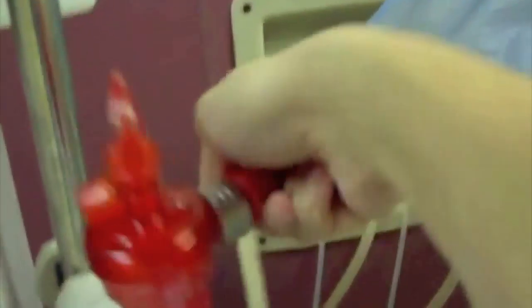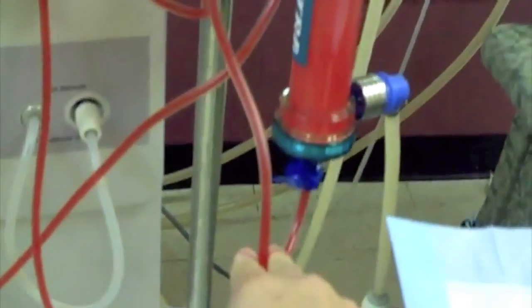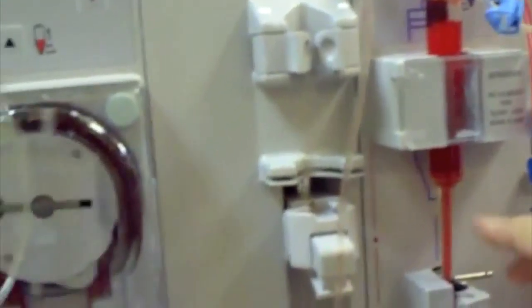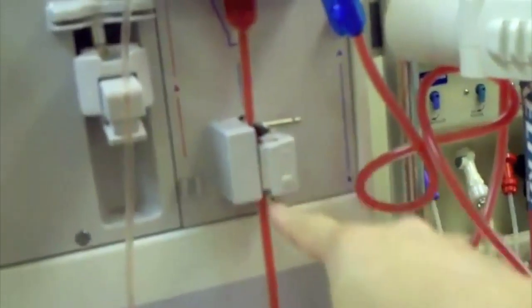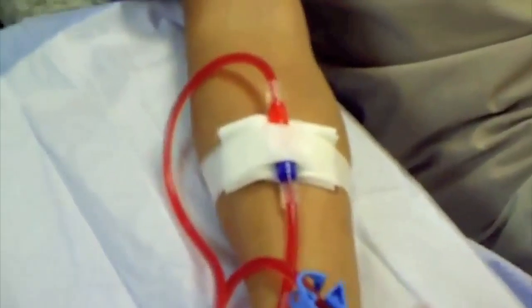This is the dialyzer. The blood from the pump enters from the red part of the dialyzer from the top, going downward into the venous chamber. This collects air, whatever's left in the dialyzer. If there is air, the air detector will alarm and the clamp will clamp so that the air won't go to the patient. This is now the venous circulation. This is the clean blood that's going back to the patient. As you can see, the blue line.